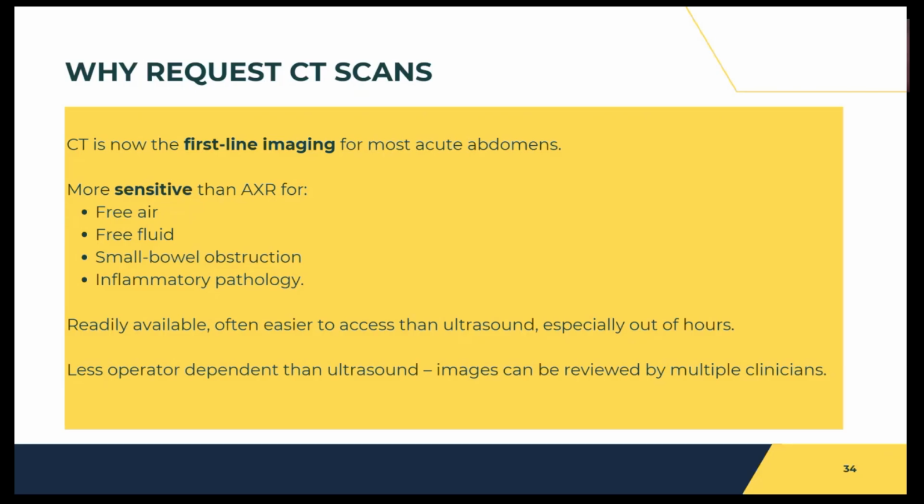I'd also like to add that CTs are less operator dependent than, for example, ultrasounds, because anyone can interpret a CT retrospectively, whereas ultrasound findings are lost the moment the probe is removed. That's why they normally prefer abdominal CTs, but ultrasounds can be used for determining, for example, the biliary tree, so the gallbladder, and any pathology associated with that.